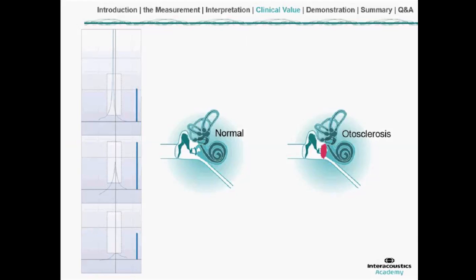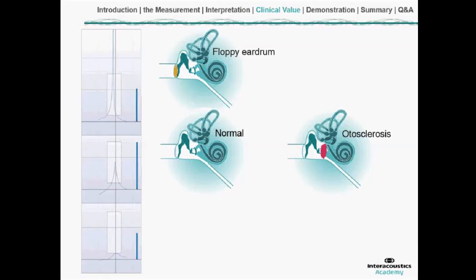With otosclerosis, there is a calcification of the stapes, which connects to the cochlea. And in many of those cases, you cannot measure with the tympanogram that the compliance has dropped a lot. Maybe it has dropped for this particular patient compared to how it was before, but probably it will still be within normal range.